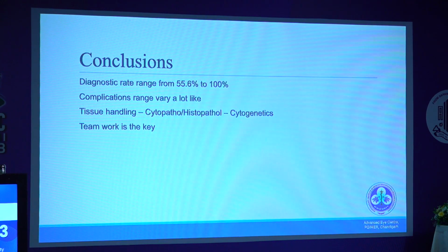What is the use of ultra wide field? Now that we have access to ultra wide field imaging modalities, multimodal, what is the role there in assessing the preoperative biopsy site, assessing with the cytopathologists at that stage, the site of biopsy, how to choose the biopsy site? Please throw some light. Ultra wide is not really going to help in these situations.